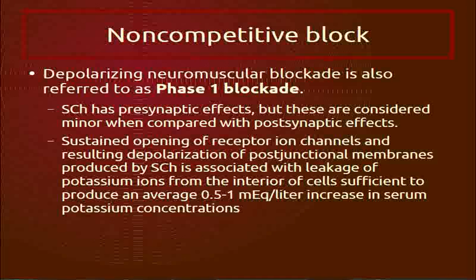But succinylcholine's block is different. If you were to do a train of 4 on the monitor to look at the succinylcholine block, it may be diminished, but all twitches are going to be equal. That is a phase 1 block, and we'll get more in depth with this.